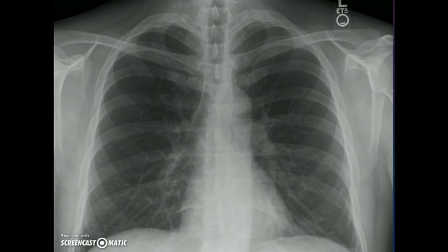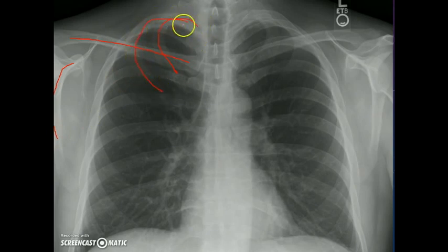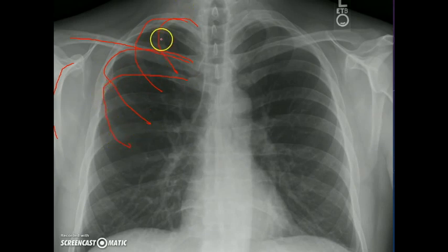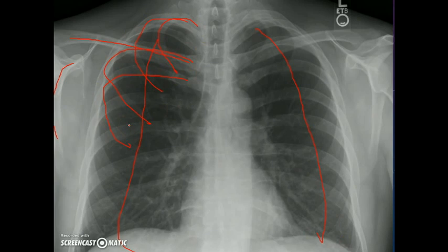After the primary survey, when we go in for the methodical secondary survey, we start by looking for the bony skeleton — the clavicle, the scapula, then each rib in order, going from the first rib to the second, third, and so on, going in a methodical manner. Go from the right side across each rib, then do the same on the left side. This will help us identify any defects in the bony skeleton — scapula fractures, clavicle fractures, rib fractures.